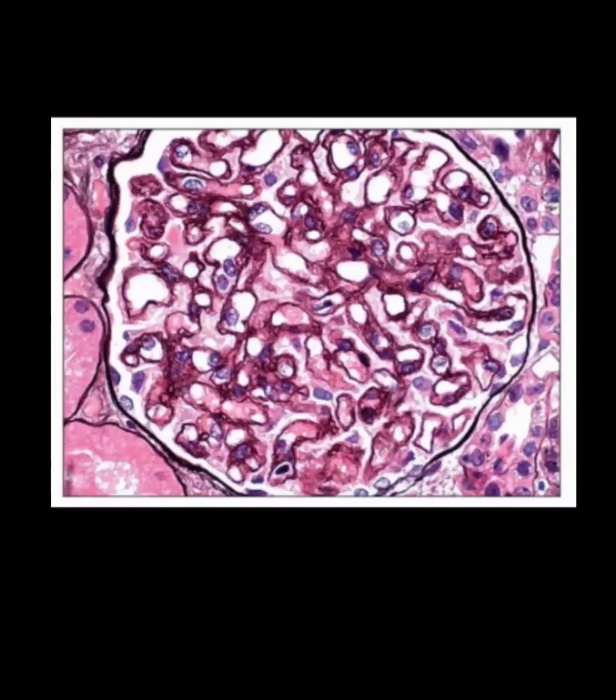Silver stain is the best for the membrane. It is showing the membrane very beautifully. Especially in any disease that is affecting the membrane, like membranous nephropathy, which shows thickening of the basement membrane, or any MPGN pattern in which there is a tram track appearance. This is a very beautiful stain that highlights the basement membrane.